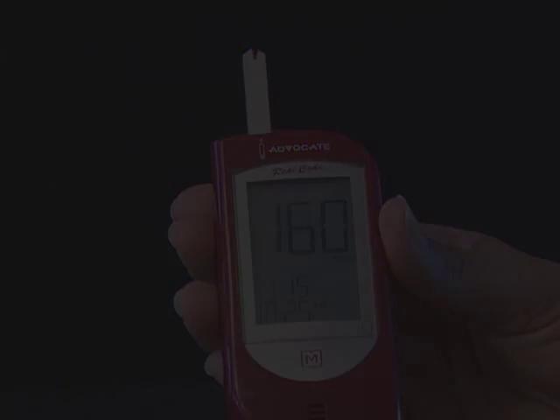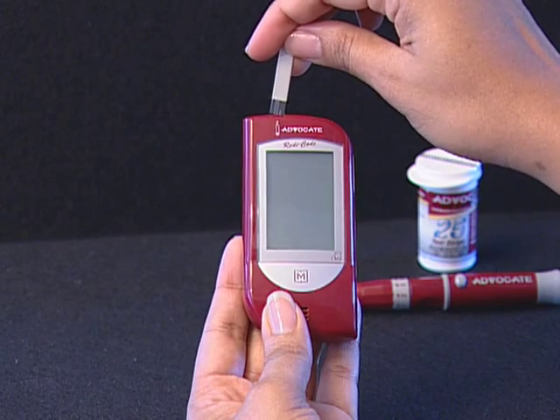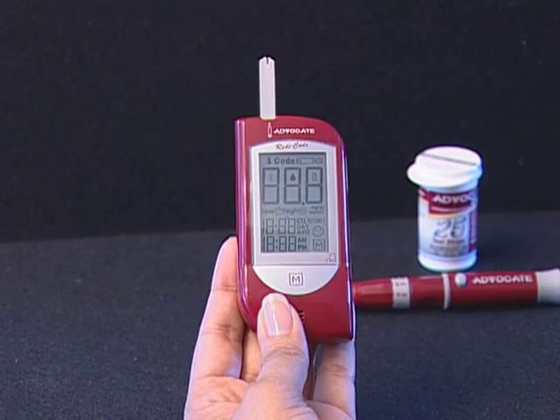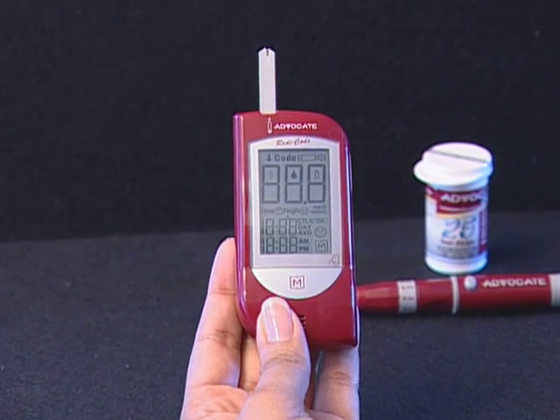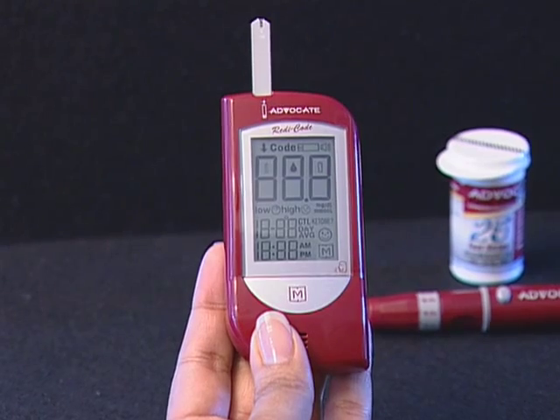You must remove and reinsert the test strip to restart the test procedure. If you find that the confirmation window is not filled with blood when the meter is counting, never try to add more blood to the test strip. Discard the test strip and retest with a new one.